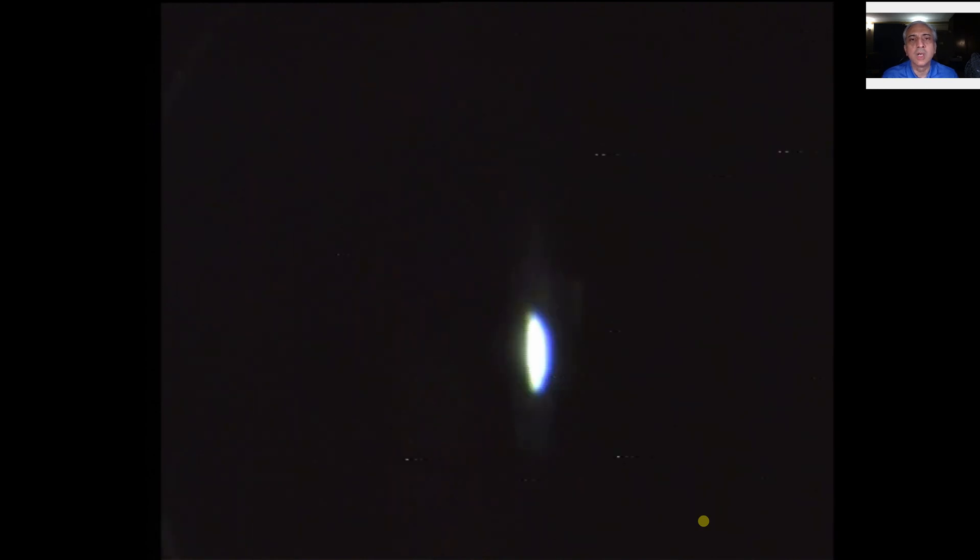Once you have it in place, you can magnify the area and look at the disc. With a 90-diopter lens the disc will appear inverted. Sometimes you see reflections and the disc is not visible, but keep moving the lens around and it will become visible. Here you can see the disc is visible. I increase the magnification, focus it, and you see a cup-to-disc ratio of 0.6 clinically on both sides, and some of the fovea is also seen.